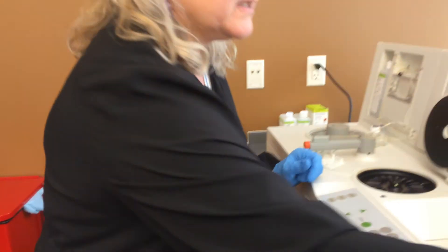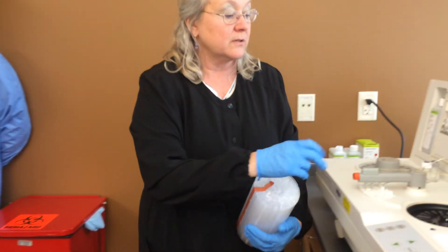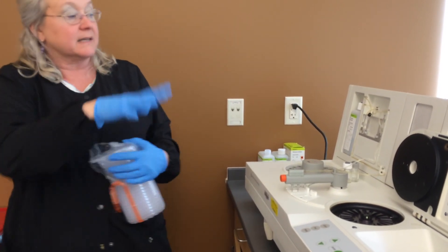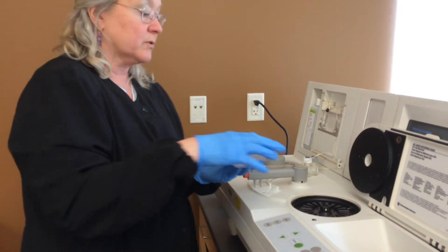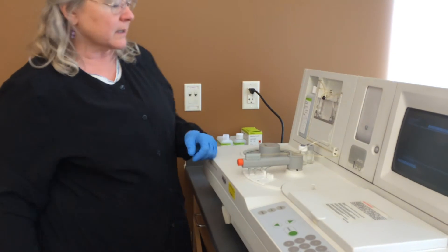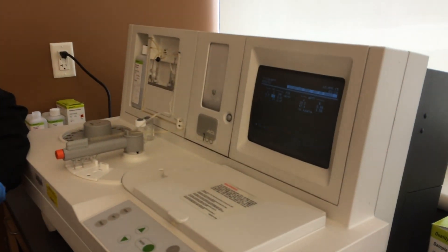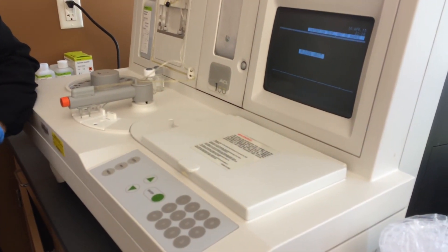We're going to put in a new rotor. Now some ACL analyzers have a constant heating mechanism, so no pre-warming time is necessary. But this is like the baby ACL, and it actually has to pre-warm this rotor to 37 degrees before it can analyze the test. So we have five samples and we're going to run both tests — we'll go ahead and program both tests.